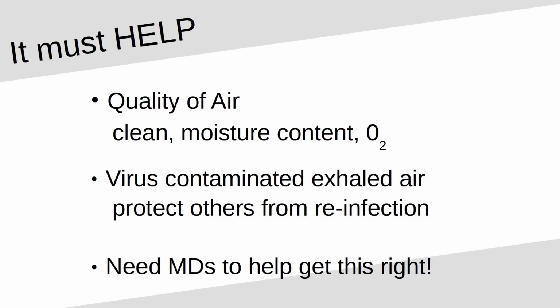Similarly, the other thing people are forgetting is, what do you do with the air afterwards? The air that the patient exhales probably has a lot of virus particles in it. You have to do something about that to make sure it doesn't infect everybody else in the room. And there are probably a number of ways one can handle that.